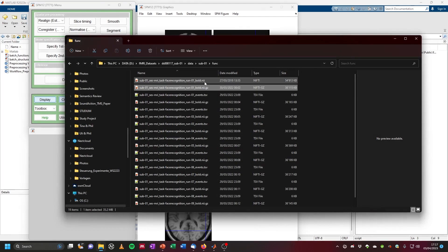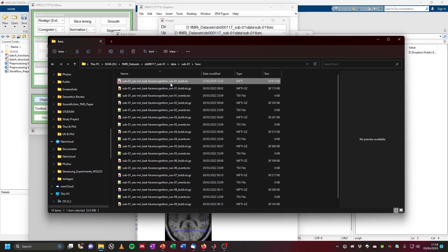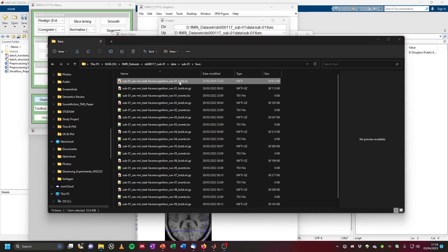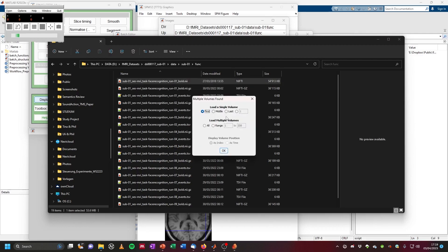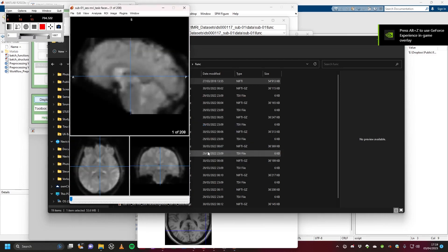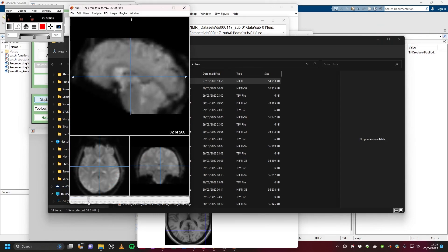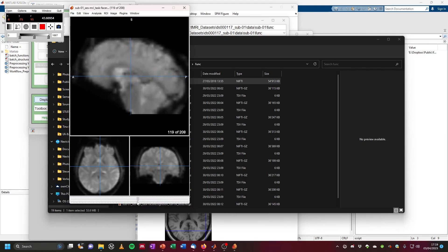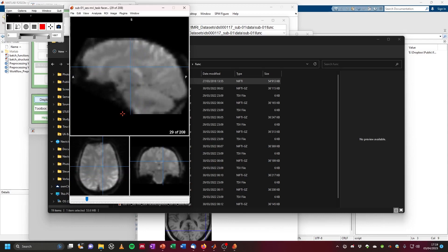Now we have our pure NIfTI file that SPM can work with. We can have a look at this — I would use Mango to open it, because then you can look at the entire scan which consists of multiple images. We have an fMRI scan that consists basically of a movie of brain volumes. When we scrub through it, you can see there's a kind of flickering going on — this is basically your brain activity measured using fMRI.